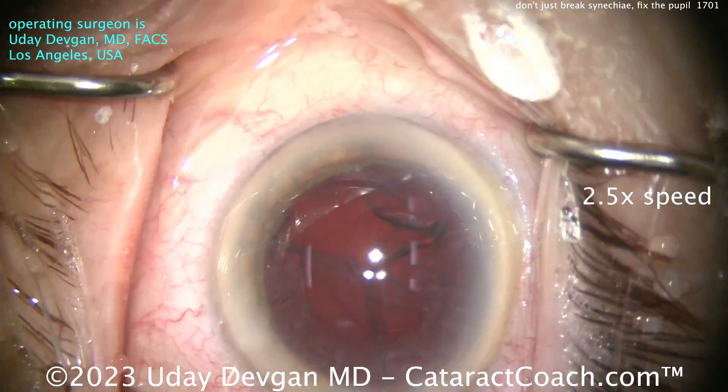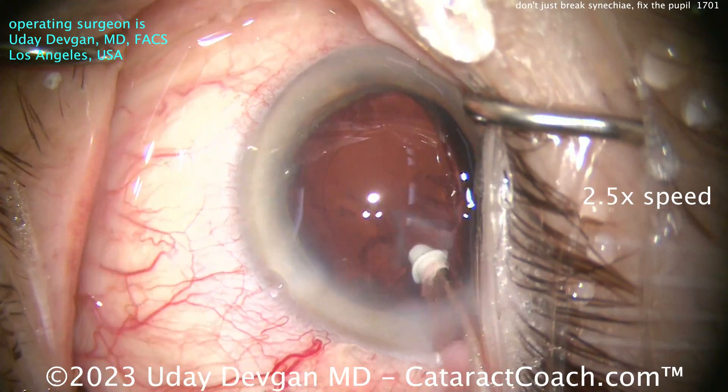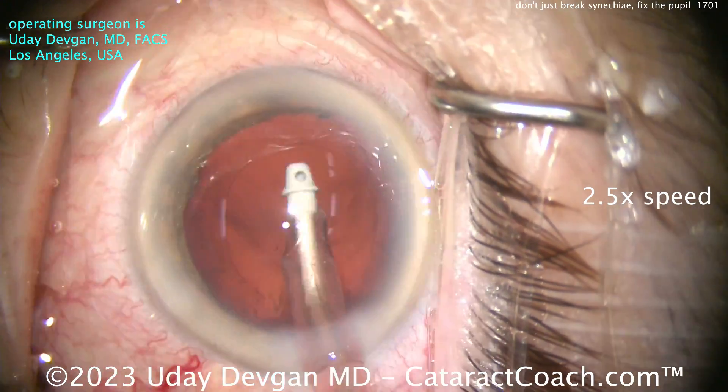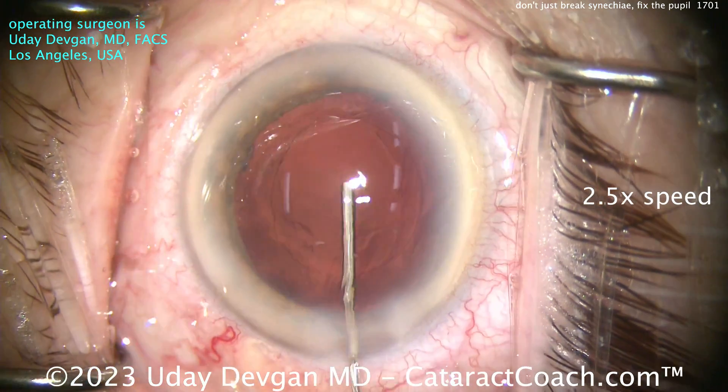This patient did have a prior history of uveitis, but had a nice quiet eye with no inflammation for about a year prior to the cataract surgery. We did pre-medicate with just topical steroids — prednisolone. We did not do any systemic steroids, and the patient did fine.